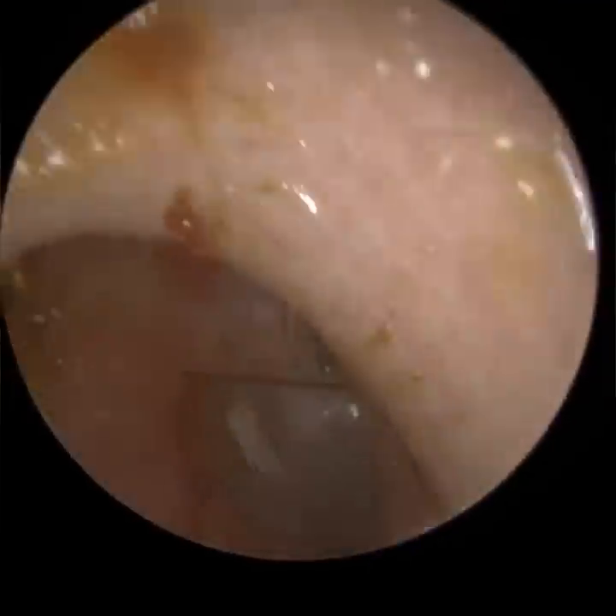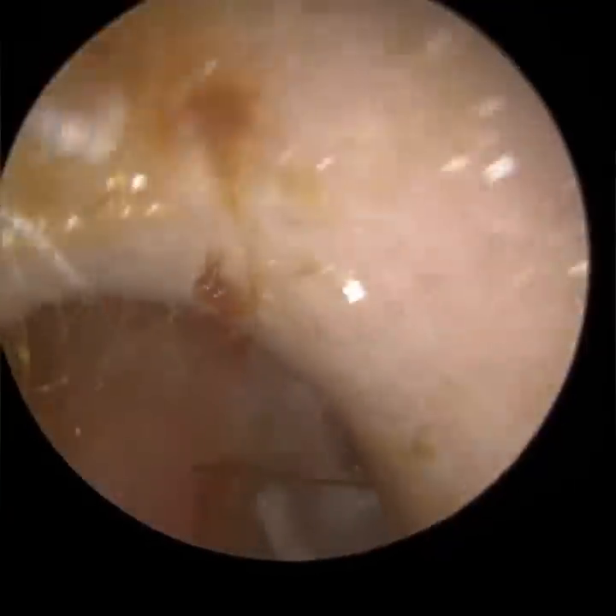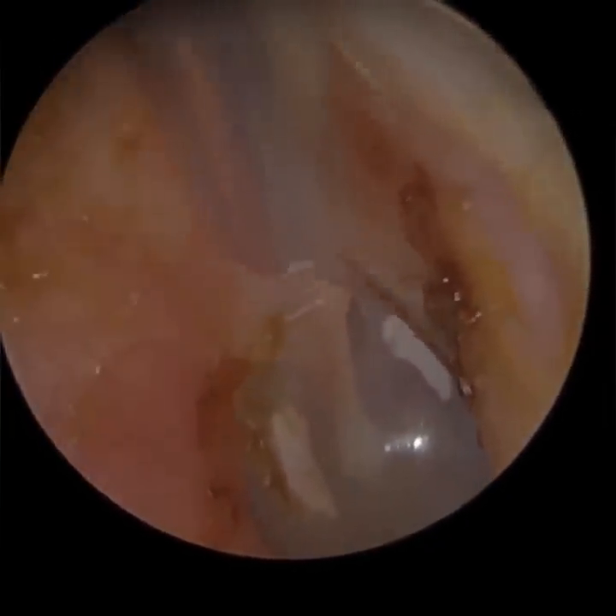Intratympanic tympanosclerosis can generally cause a hearing loss, whereas myringosclerosis, if it's exclusively on the eardrum, doesn't always. You can see here this patient has myringosclerosis both anteriorly – to the front part of the eardrum at three o'clock – and also posteriorly at nine o'clock.